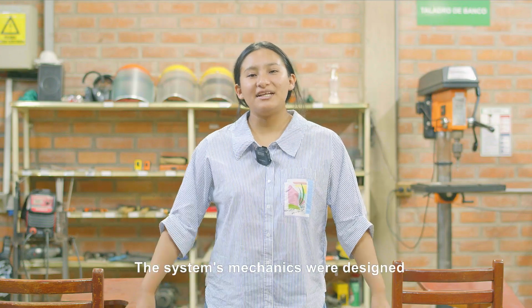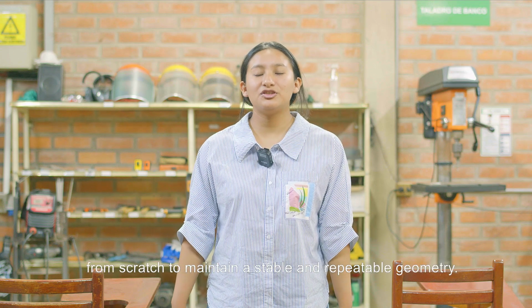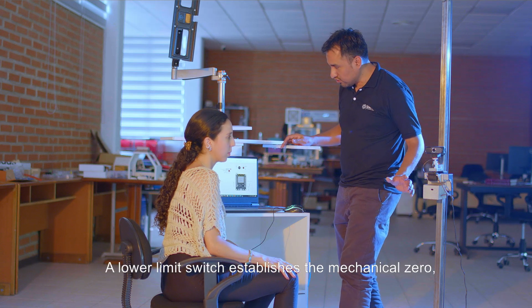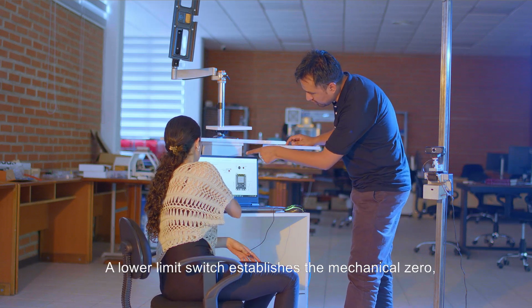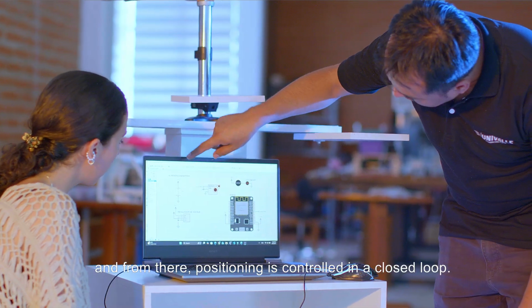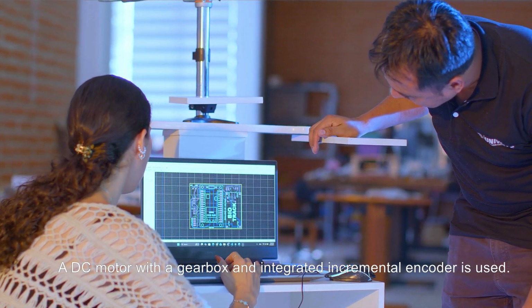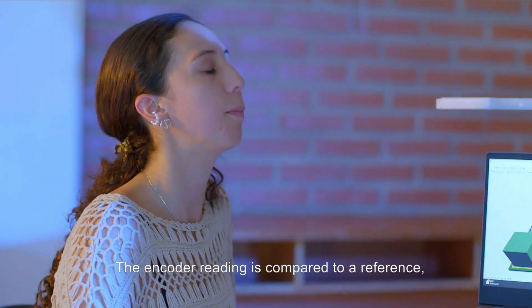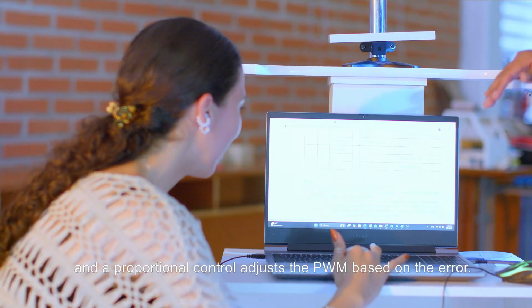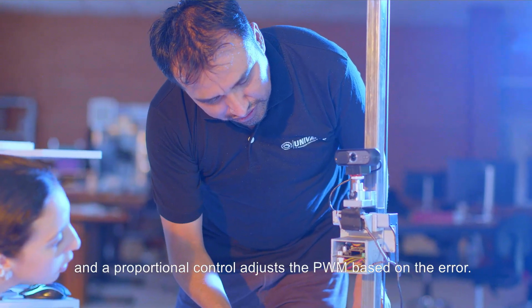The system's mechanics were designed from scratch to maintain a stable and repeatable geometry. Each session begins with a homing process. A lower limit switch establishes the mechanical zero, and from there positioning is controlled in a closed loop. A DC motor with a gearbox and integrated incremental encoder is used. The encoder reading is compared to a reference, and a proportional control adjusts the PWM based on the error.